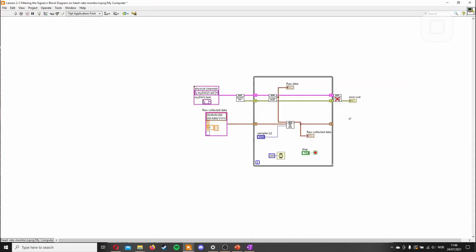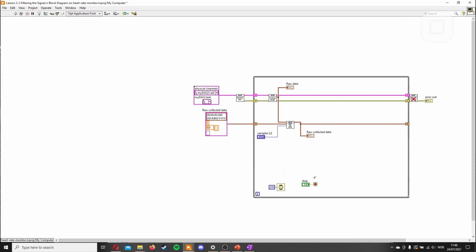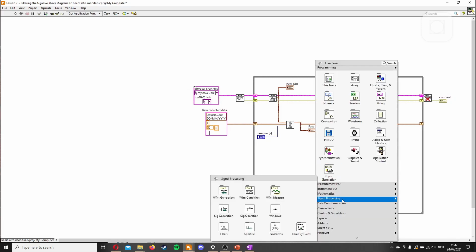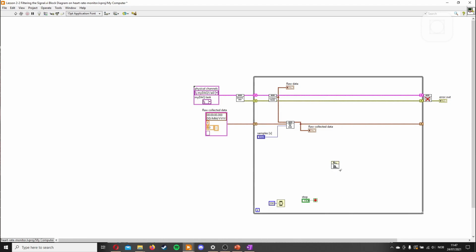We'll just stop it. And we'll just expand this a little bit so we have room to operate. We'll just leave this one here too. So I hold Control to move it this way. We'll start by picking up a filter. We'll go to signal processing and then filters, and here we'll select a Butterworth filter. There's a lot of other filters too, but we're not focusing on the different types of filter. We just want a filter that works.